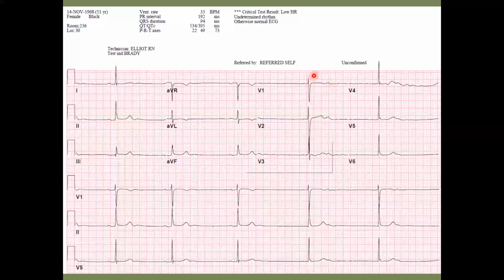All right. So what's happened here? This person was in sinus bradycardia. Then they dropped into a junctional rhythm. So this is coming out of the junction where the AV node and the bundle of His are, right in that area. You have pacemaking cells that have the capability of pacing the heart generally between 40 and 60 beats per minute. And then the SA node fired, but the ventricles had already depolarized based on the junctional escape rhythm here.